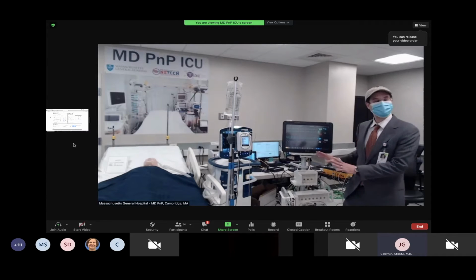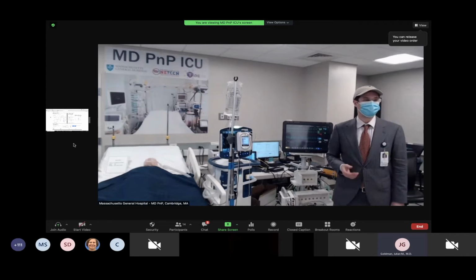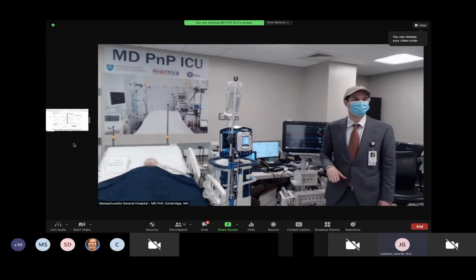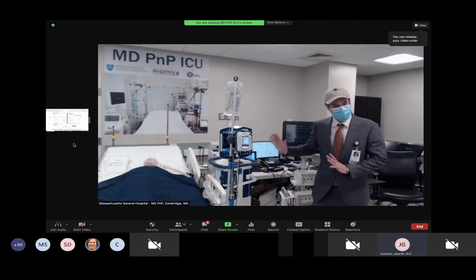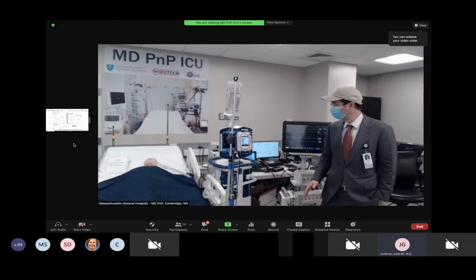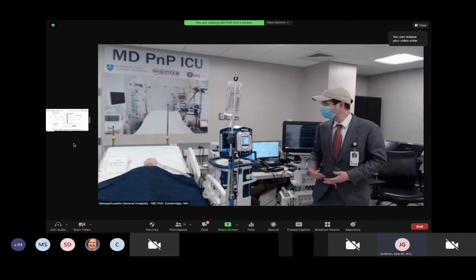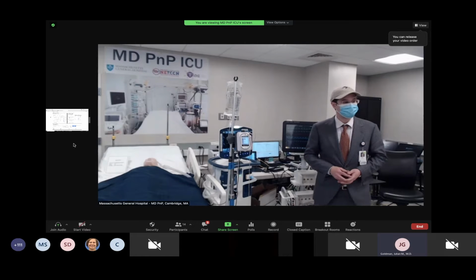These devices are connected through two parallel systems. All of the devices are connected to our OpenICE research interoperability platform, and the ventilator is also connected to a Medtronic remote control software for non-clinical use here in the lab. So, having set the stage, we'll now start our scenario. I am the nurse in this room. I'm not very familiar with this particular ventilator or how to change it or how to help this patient, but I know that their oxygen saturation is low and that their blood pressure isn't great either. So I'm going to call for a remote teleconsultation and ask for some help.